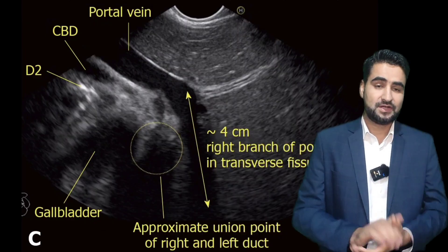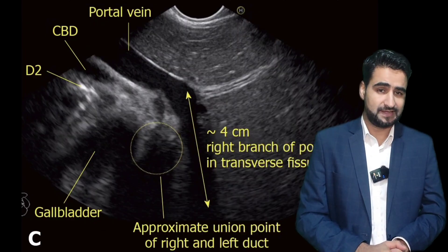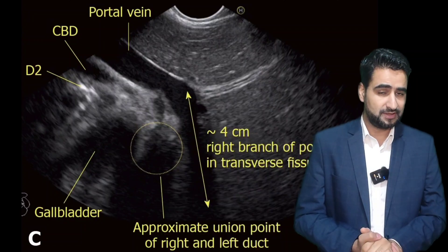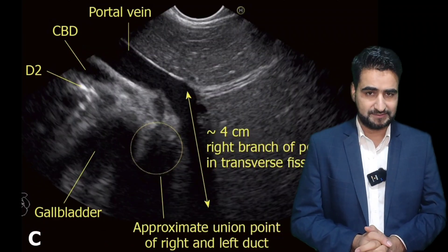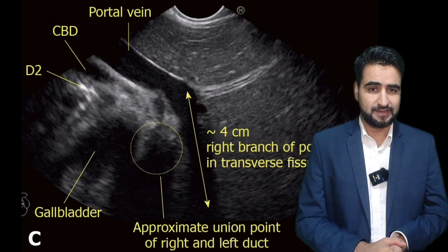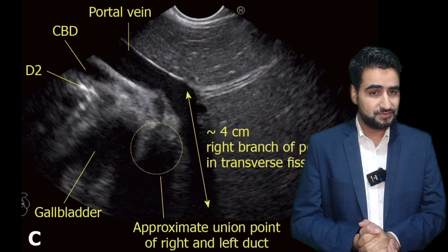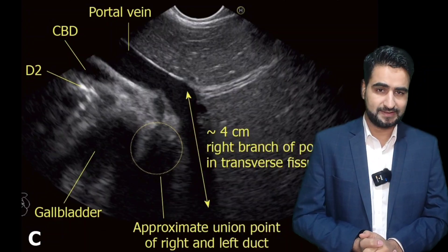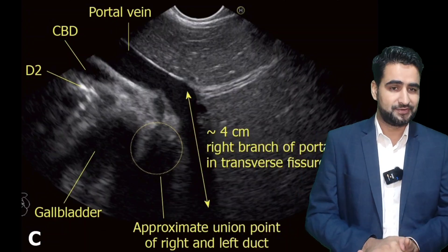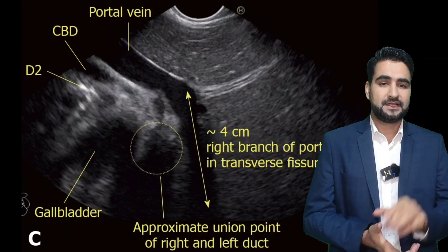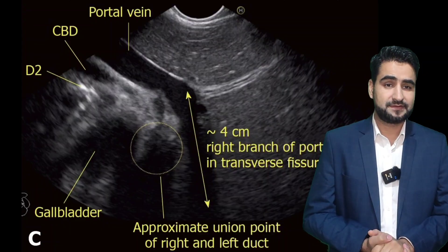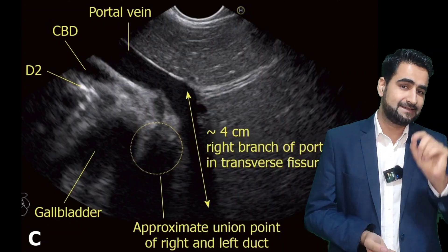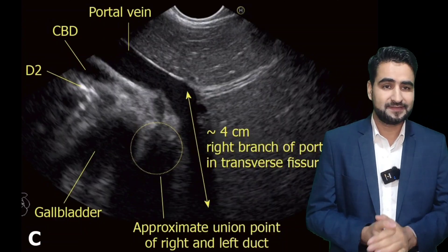Next, in this image, we focus on the transverse fissure itself. The breadth of this fissure — the distance within which the right branch joins the left — is roughly four centimeters. Several landmarks become visible here: the D2 segment of the duodenum may appear inferiorly, the gallbladder might also be seen anterior to the portal structures, and the portal vein continues horizontally as it branches. This four-centimeter segment is clinically relevant as it is the operative field during hepatobiliary surgeries and an essential reference during EUS-guided interventions.